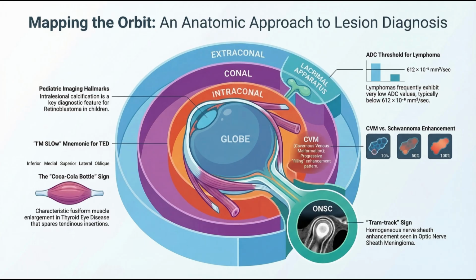And when that child gets an MRI, what is the radiologist looking for inside the globe? They're looking for a very specific footprint left behind by the tumor. Retinoblastomas are notorious for calcifying. They build up tiny deposits of calcium. And how does calcium show up? Well, on specific, highly sensitive MRI settings, calcium doesn't light up. It actually creates these dark, empty-looking voids. Like black holes. It looks almost like tiny black holes scattered within the mass inside the eye. The presence of those dark calcium holes is a major diagnostic indicator.